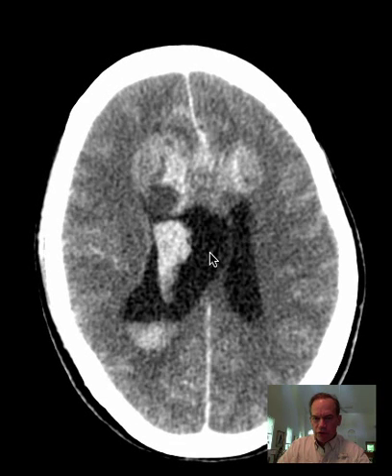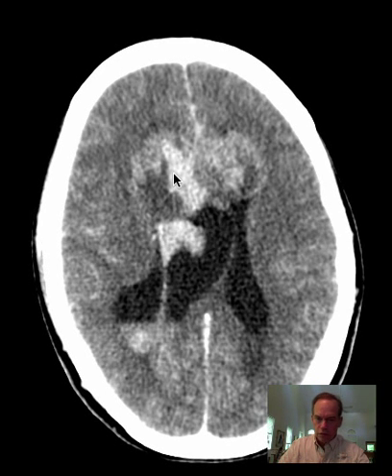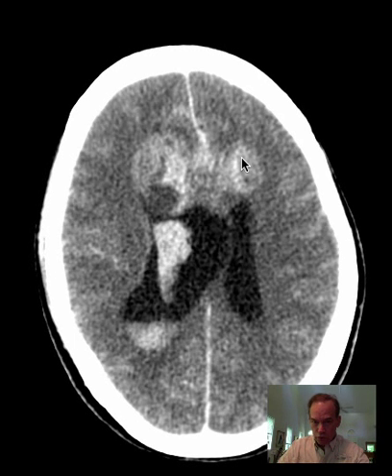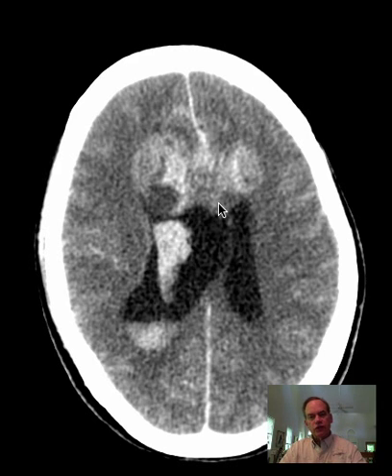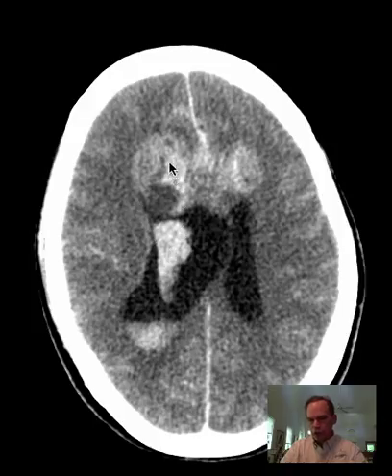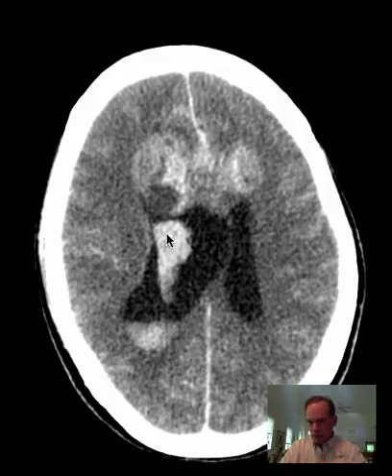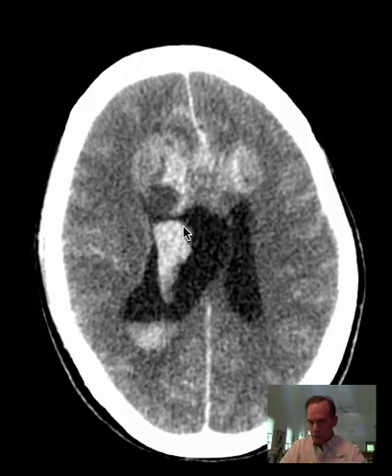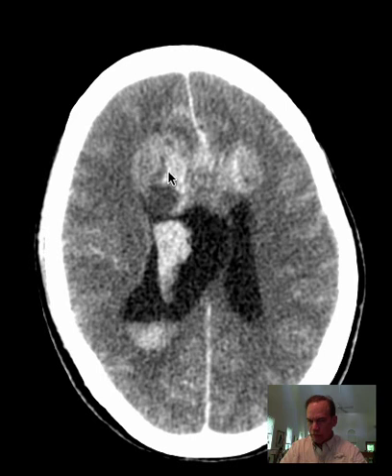You can see this butterfly has a larger right wing than a left wing. It's a little bit difficult to discriminate the margin of the tumor from the surrounding brain. You can see what looks like some blood in the mass and some blood dripping down from it — probably a big clot — so the clotted portion remains here and the liquid portion of the blood from the tumor is layering in the dependent aspect here.